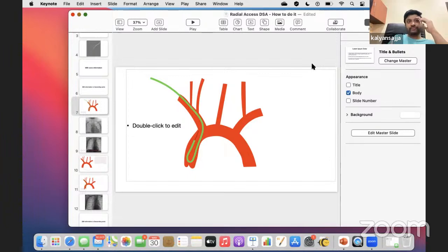For the strokes, for basilar occlusions, I sometimes forget, but many times, if you have a CT angio, just go to the side with the bigger vert. Many times, in some cases here, they're not doing CT angios. We're just bringing them direct to the cath lab.